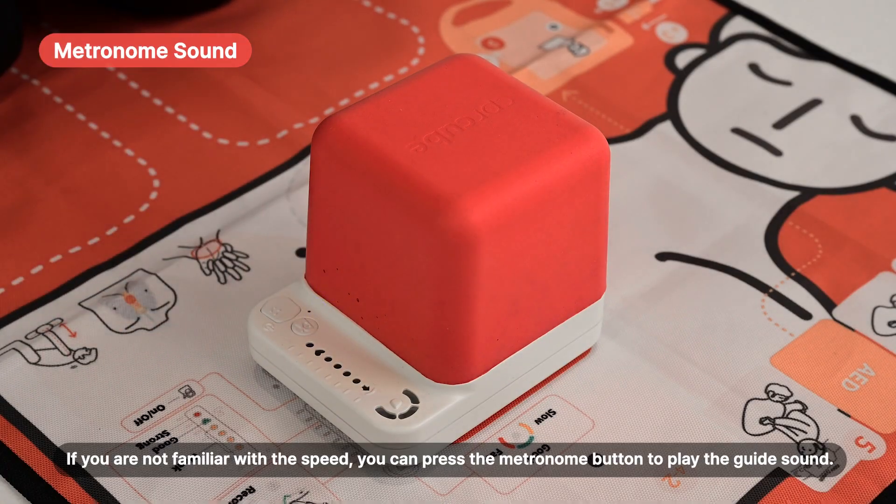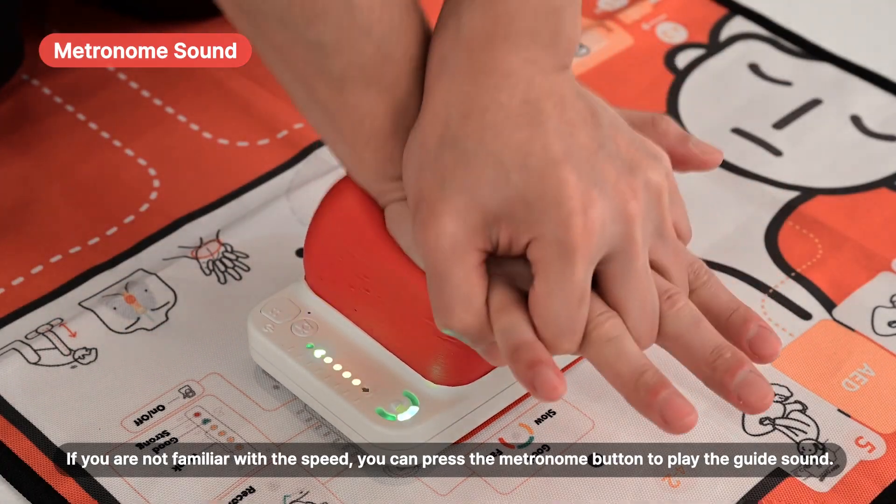If you're not familiar with the speed, pressing the metronome button will play the guide sound.